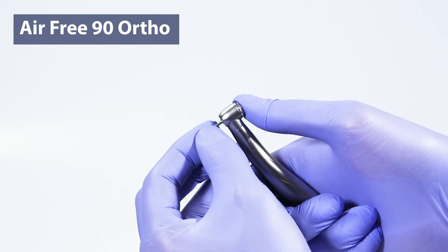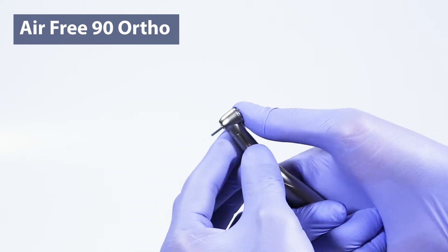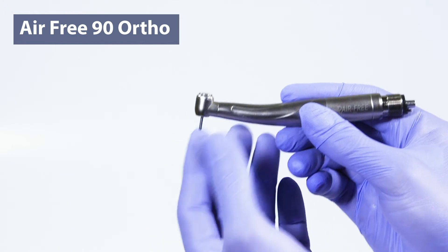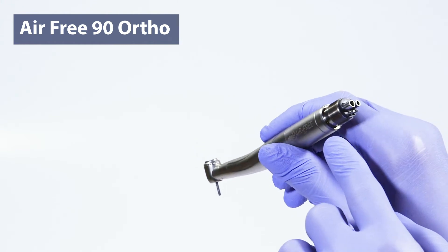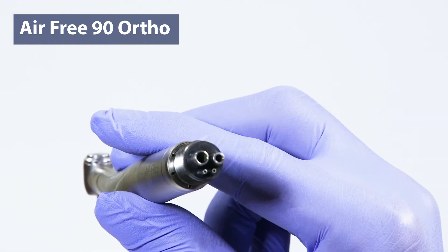Unlike conventional high speeds, the AirFree90 is designed to eliminate patient sensitivity and discomfort by redirecting the cold air from the debonding site through exhaust ports located at the back end of the handpiece.